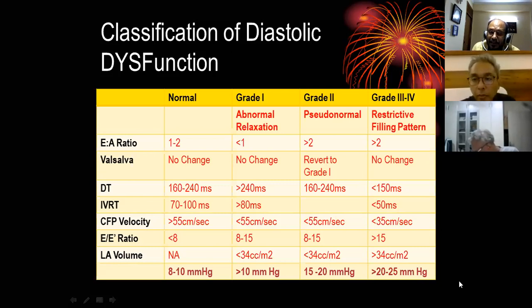So what we did in that patient, we did a complete evaluation by these 4 methods, classified her into grade 2 or grade 3 diastolic dysfunction with raised LA volumes with congestive cardiac failure, and used ACE inhibitor with diuretics. Her tachycardia disappeared over a period of time.